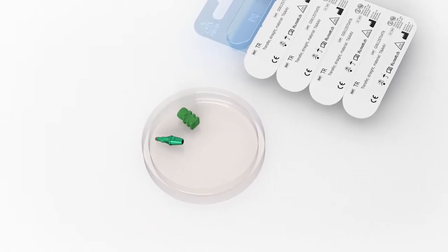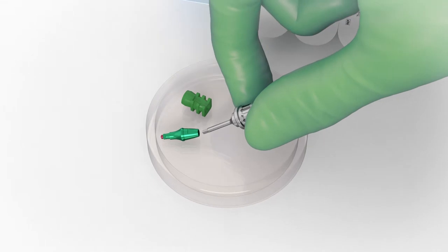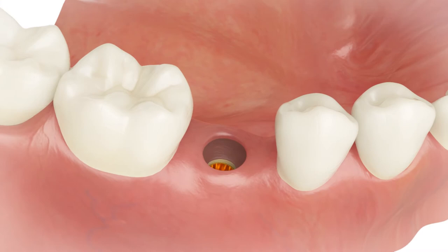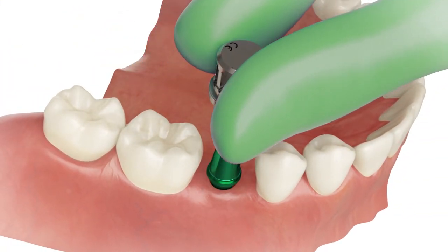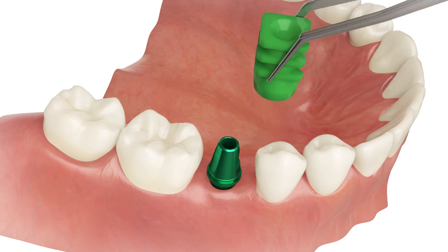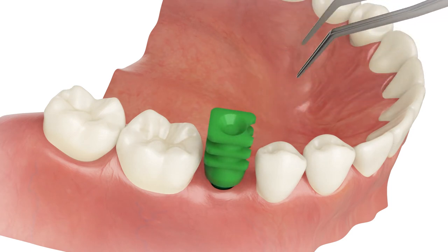Place the screwdriver to the transfer's hex. Manually insert to the implant. Put the transfer cap on the transfer.